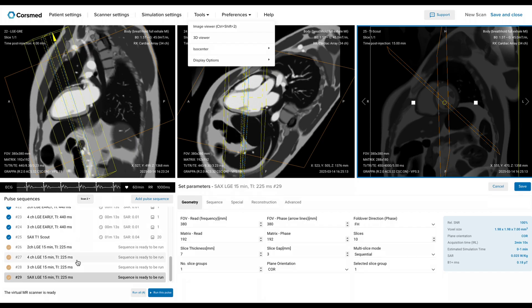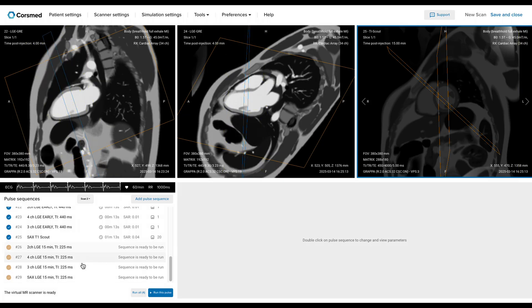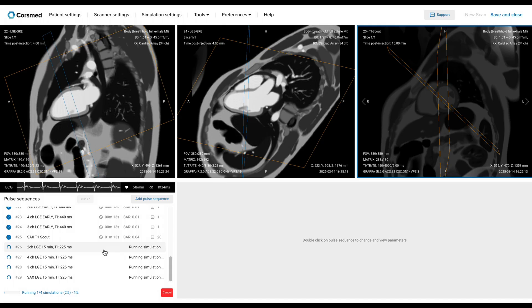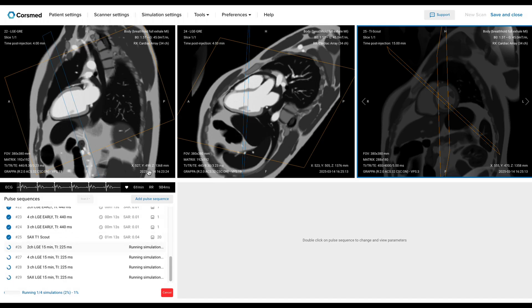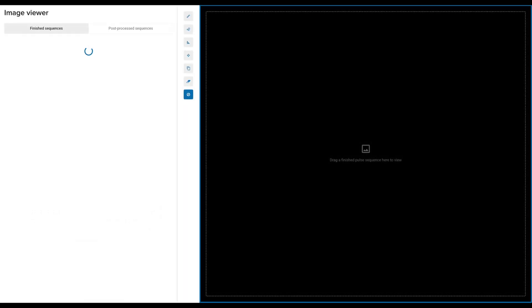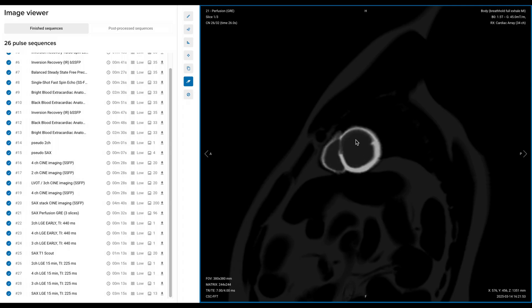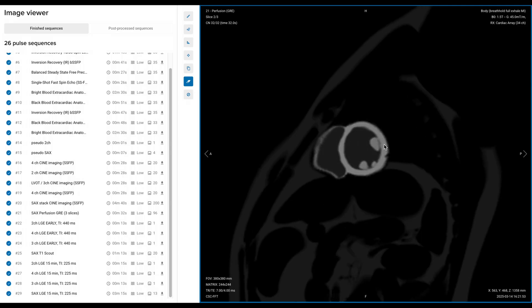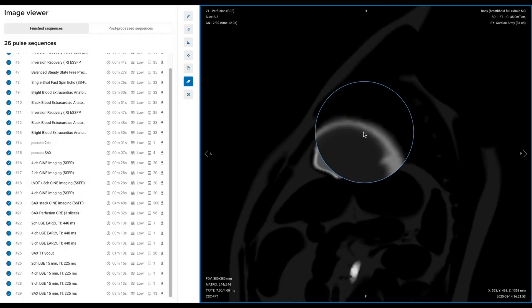Let's now return to our sequences. These late gadolinium sequences are pretty much set up because it's still the same case. Let's run all these sequences. While this runs, we can start reviewing our images. Let's open our image viewer again and start with our perfusion images. I want to look at the perfusion defect that corresponds with the scar.